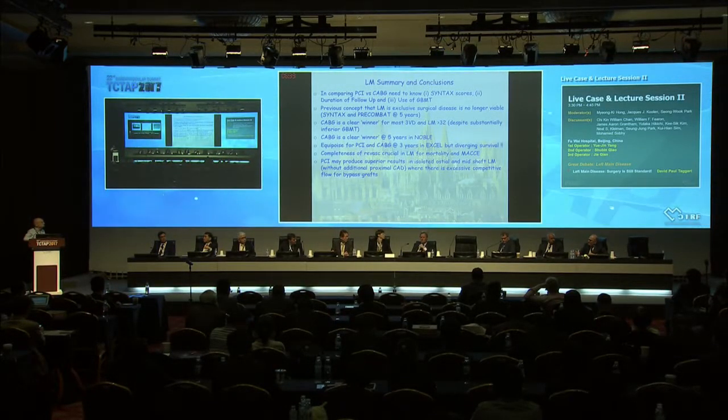we catheterize a lot of patients who are post-op. We look at branches that we consider to be very large, and they've never been grafted, even though the patient may have other grafts. I don't really know how frequently that occurs. I think, probably as part of ART, you ought to do that. You ought to get us that answer and get that for your fellow surgeons. I think that's very important for us to know.